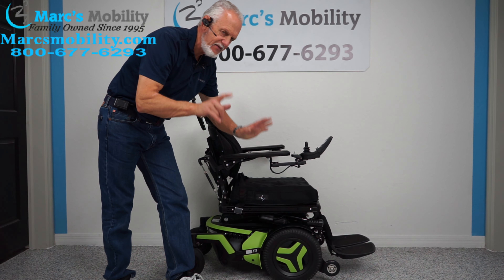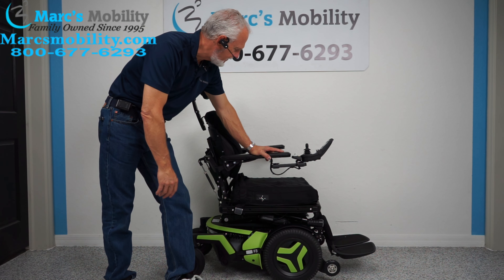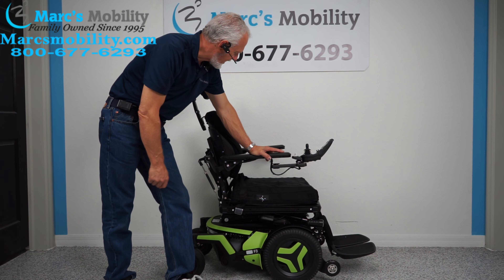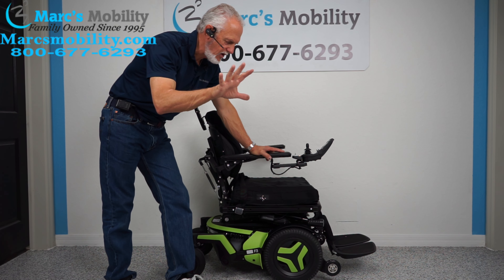This chair has 7 miles, so it's practically brand spanking new. It was delivered probably just about a week or so — just about 7 miles. This chair has 5 electrical functions.